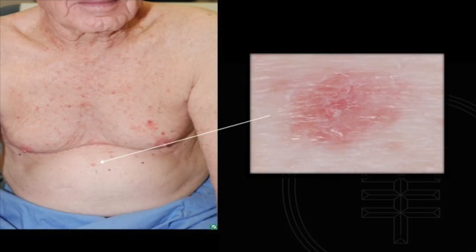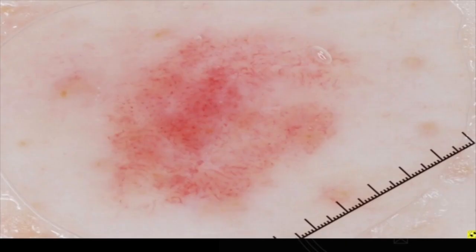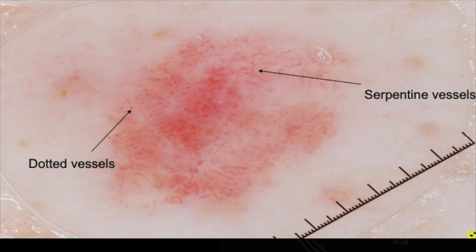And so here's, again, the power of dermoscopy. So here's a lesion on the abdomen. This guy has had lots of basal cell carcinomas. My mind is basal cell carcinoma. The guy is dry, so this is a little bit of xerotic skin. So pink lesion, probably basal cell. I'm expecting to see arborizing vessels, maybe some shiny white blotches and strands, right? Now I put my scope on, but instead of seeing that, this is the picture I get, right? Total disconnect. Vessels, dotted and serpentine, right?